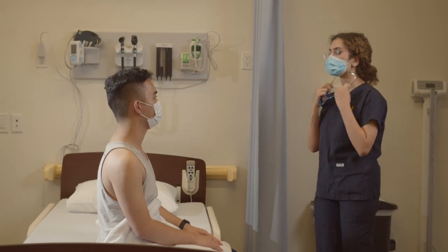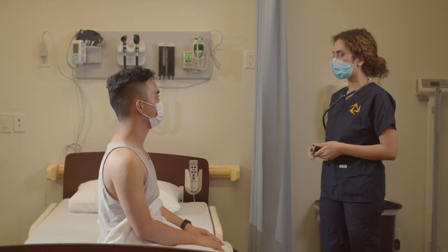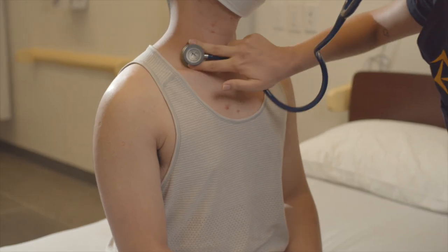I'm going to start by placing my stethoscope on several locations of your upper chest. Each time I do, I need you to take a deeper than normal breath in through your mouth and out. If you need to take a break because you get dizzy or short of breath, please let me know. Breathe, please.